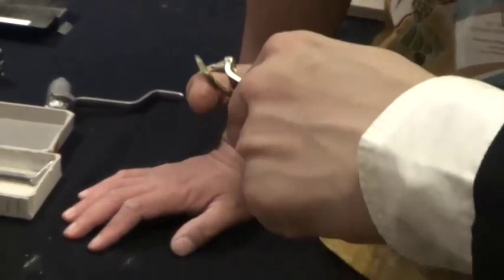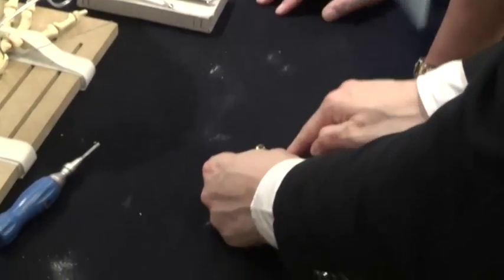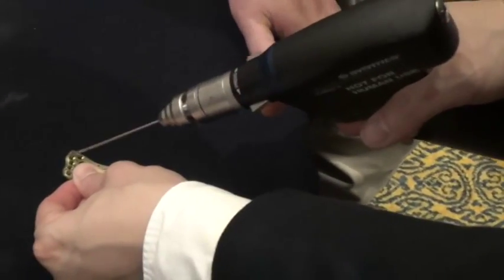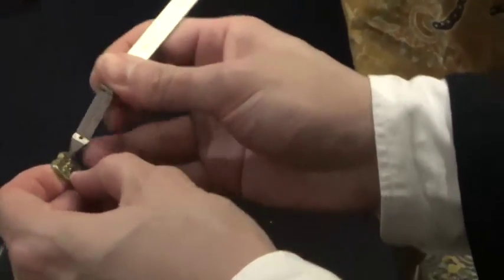So it has to be like that. For every hole you can do it, but you have to sit it perfectly. So the first one I drill this hole, so I can adjust up and down, left, right, like that, right? And then the first hole is ulnar. Number two, number three, number four, and then number five, I variable angle. So all these ones I use the fixed angle, like that.